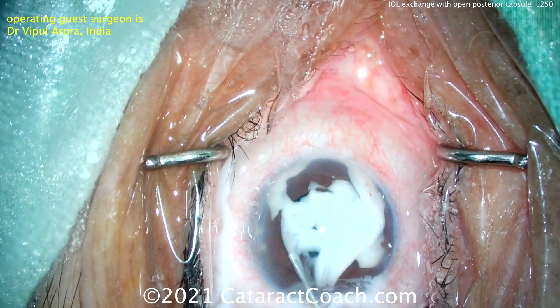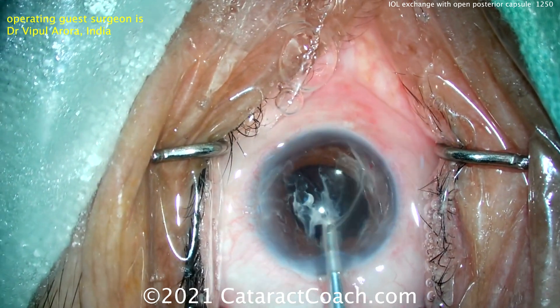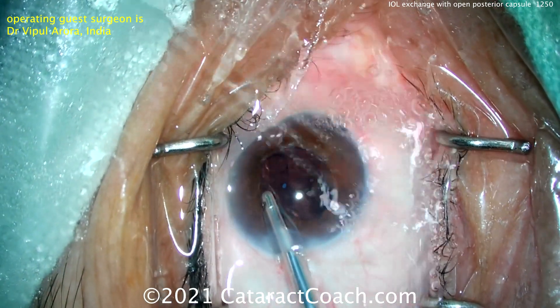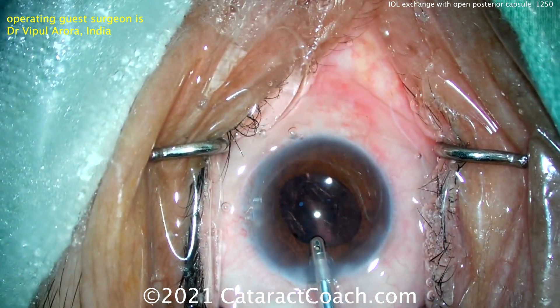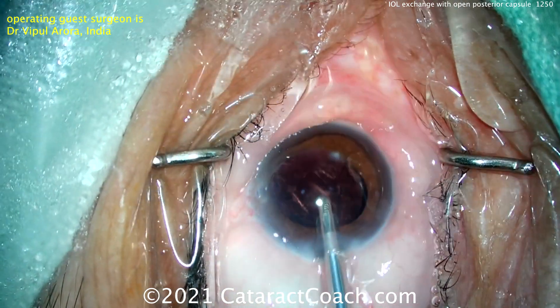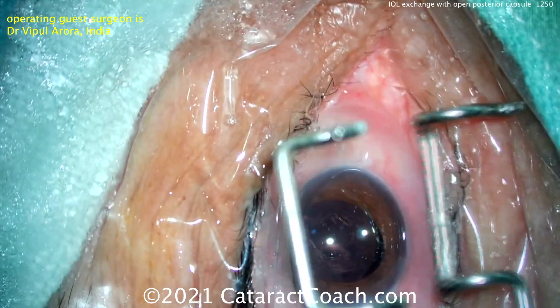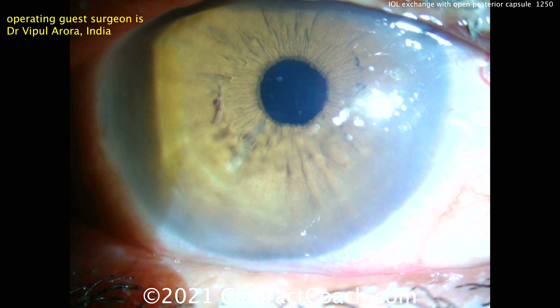A little Triamcinolone going inside the eye — though I'd first take out the viscoelastic before doing that Triamcinolone. Now going in with viscoelastic removal with the I/A probe. Be gentle here — you don't want to bring up any vitreous that's right behind that IOL optic, because you have an open posterior capsule. Very nice gentle technique. If there's a little viscoelastic behind the IOL, don't worry about it. Also for these patients, set appropriate expectations — some patients think an IOL exchange will give them perfect vision. It never gives perfect vision — better, yes, but never perfect. Thanks for sending the video in.